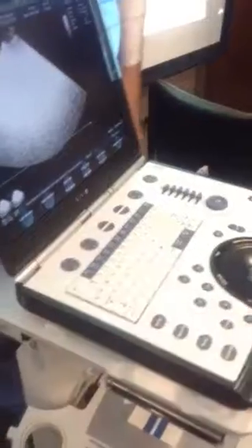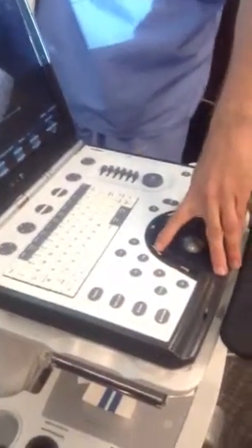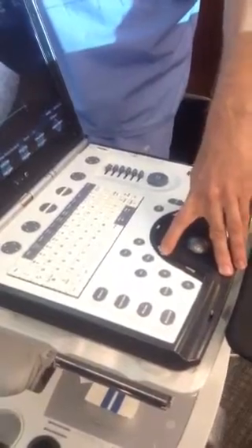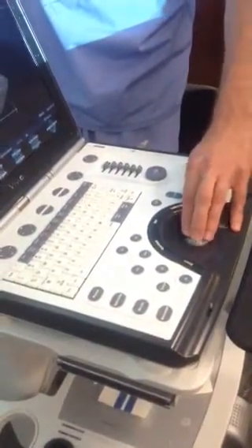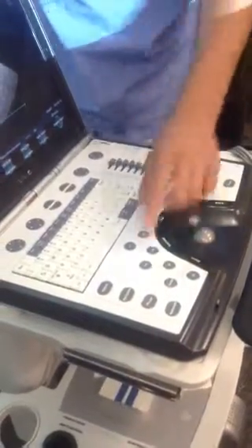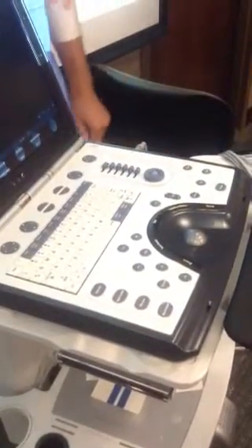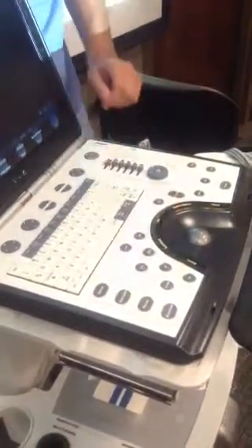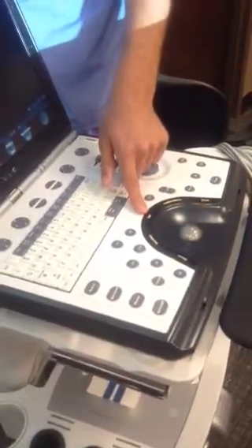Go and double click it. Oh, yeah. So if you want to see what's stored, you hit this trackball button right here. It's going to bring up a cursor, and then you can just follow your beats here and double click on that, and it's going to show. Or you can hit review, and review's going to show them all. Okay. So you have two options there. Double click on where? Here? This is your double click button. Set is your enter button on this.